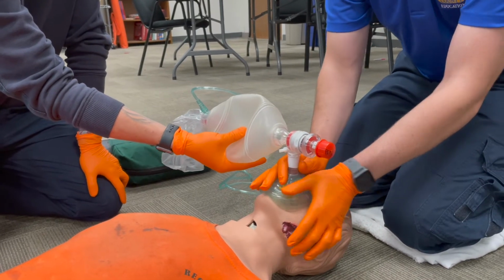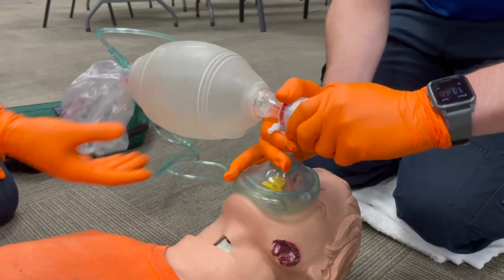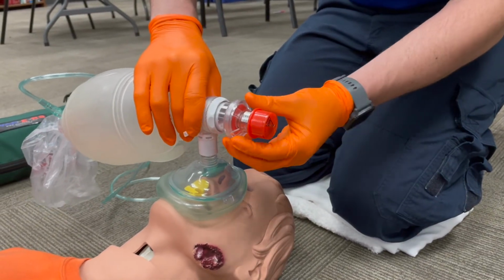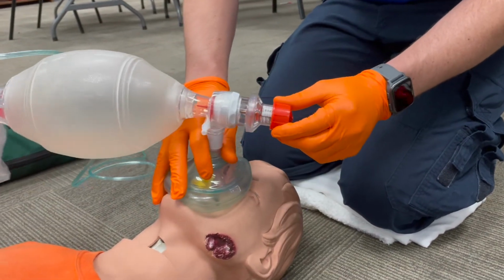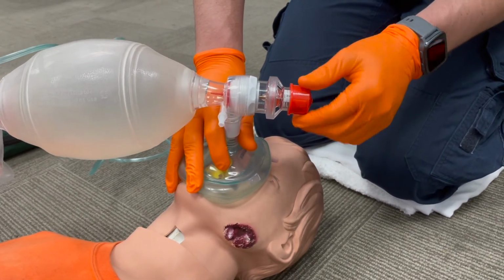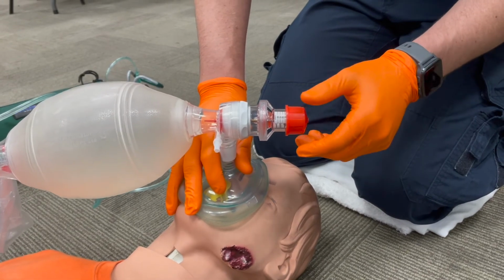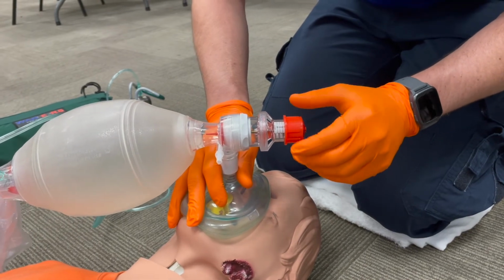The other thing we'll talk about here is the PEEP valve. You should almost always have a PEEP valve on your BVM. That's this piece right here. It won't always come on it, but you should pretty much always use a PEEP valve. That allows you to apply positive end expiratory pressure while you're manually ventilating a patient. So these work, you can set different levels of PEEP by twisting the red knob here all the way from no PEEP at all with it unscrewed all the way to 20 centimeters water of PEEP if it's screwed down all the way. Generally, you're going to start at 5 and then go from there.